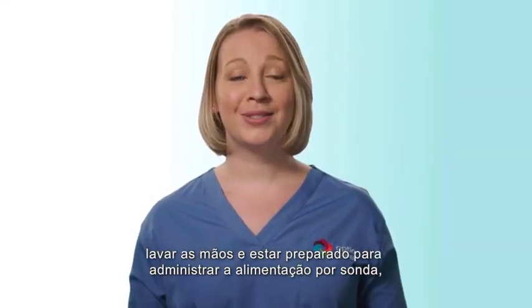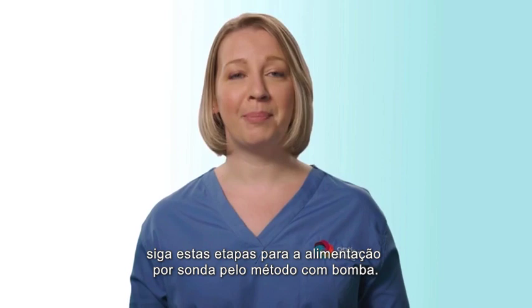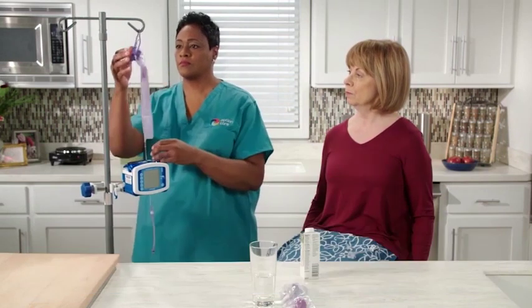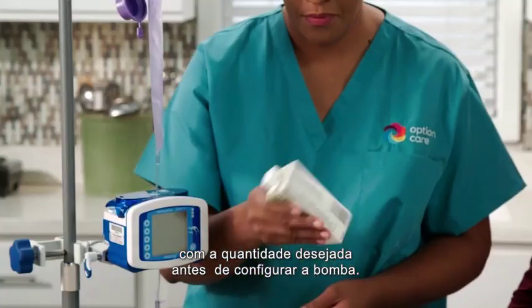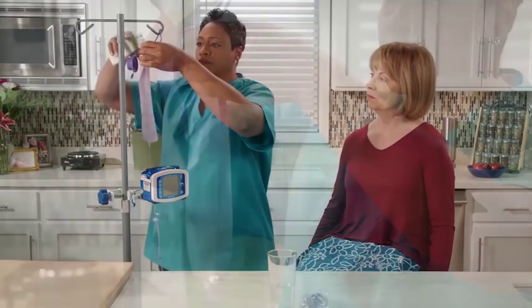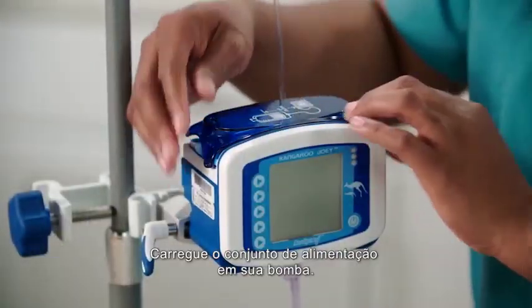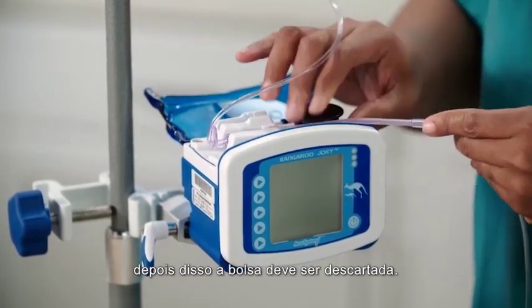When you have gathered your supplies, washed your hands, and are prepared to administer the tube feeding, please follow these steps for tube feeding by pump method. Begin by hanging the feeding bag set on an IV pole or alternate hook, if available. Open the lid and fill the feeding bag set with the desired amount prior to setting up the pump. Load the feeding set into your pump. You may use the same bag for 24 hours, after which the bag should be discarded.